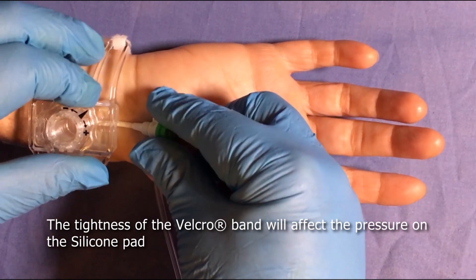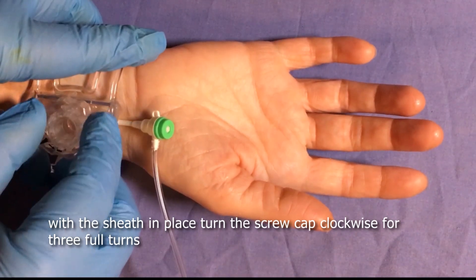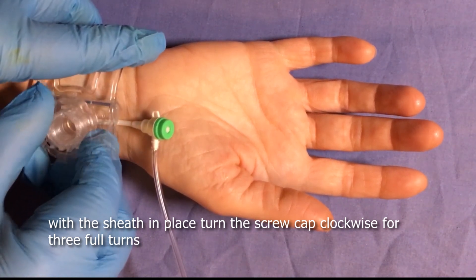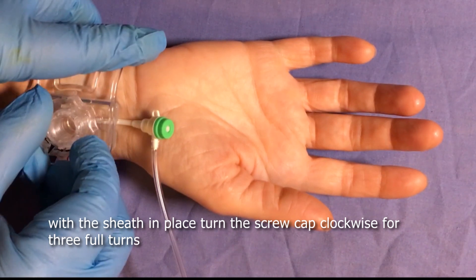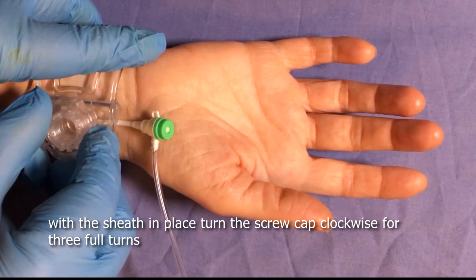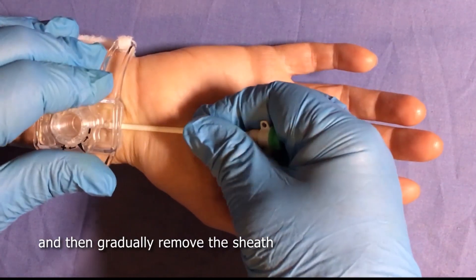The tightness of the velcro band will affect the pressure on the silicone pad. Once the band is secure with the sheath in place, turn the screw cap clockwise for three full turns. Then gently and gradually remove the sheath.